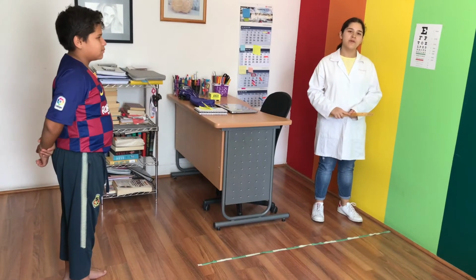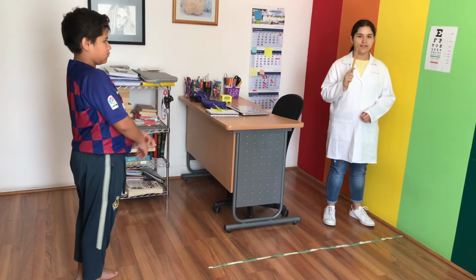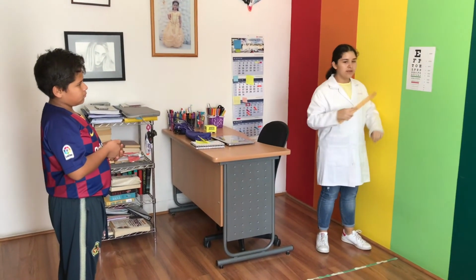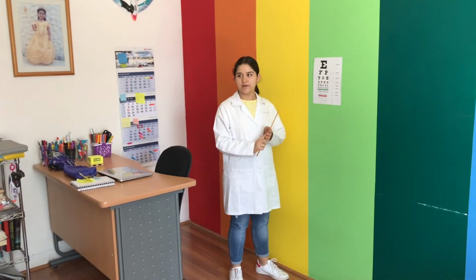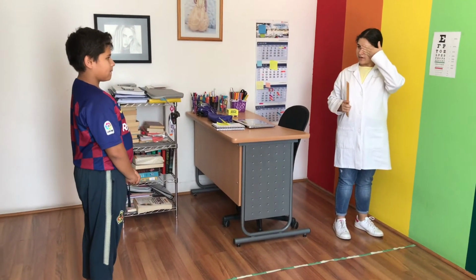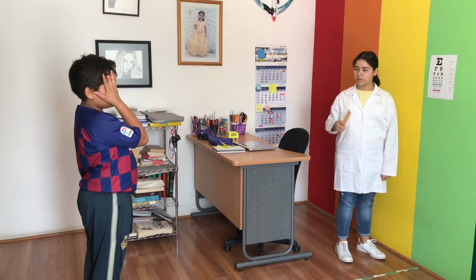So now we'll be moving to our last part of the test, the hearing test and the sight test. For the sight test, we'll be using this model. It's called the Snellen. So we have to place the board 2.8 meters from the person. So let's start. I'm gonna ask my brother a couple of questions and he's gonna answer. First, you have to cover your right eye or your left eye without pressing.